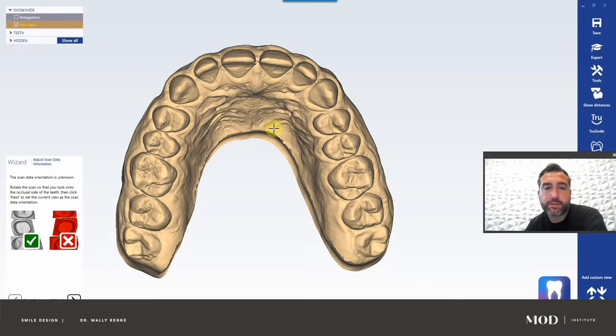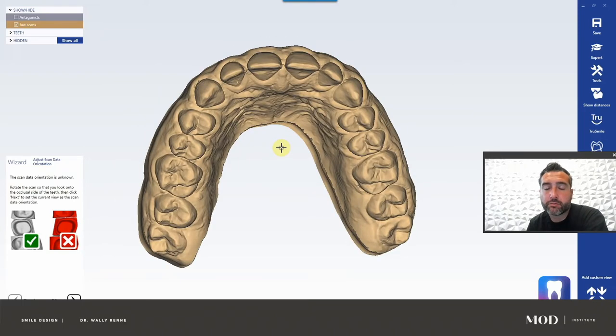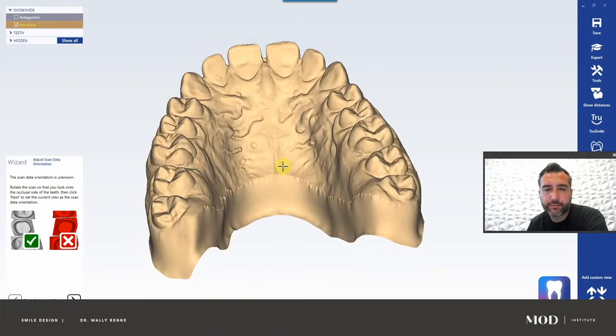Things such as vertical dimension, anterior guidance, posterior disclusion, mutually protective occlusion — we could talk about virtual articulation, but this tutorial is really just designed for a quick dive into digital smile design and 3D sculpting. Let's just do that so as not to get you guys bogged down with all the details.